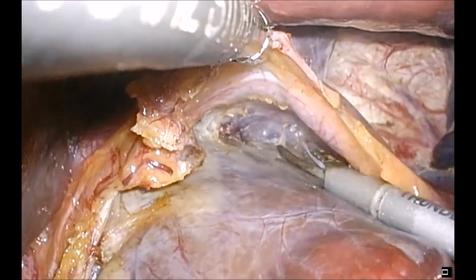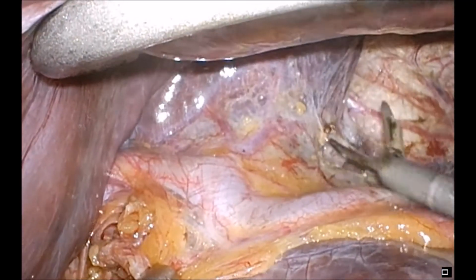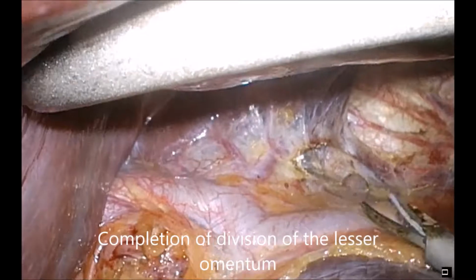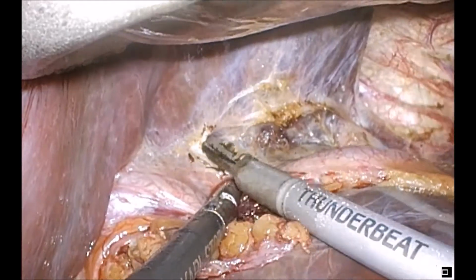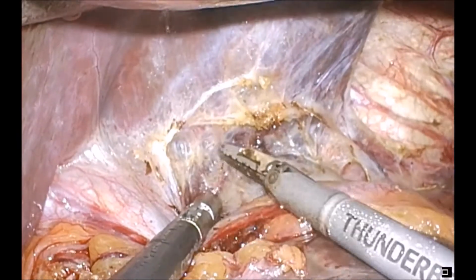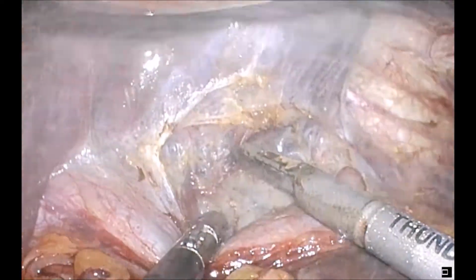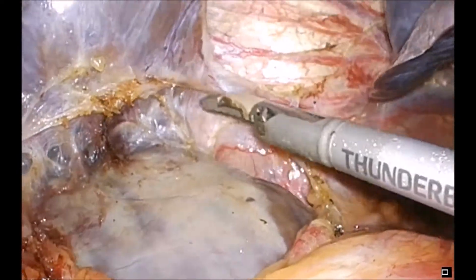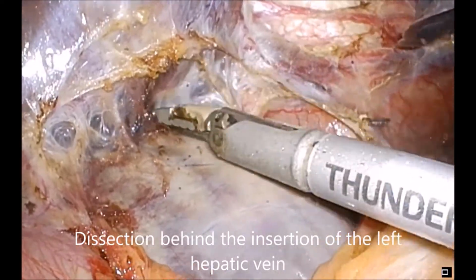You can see here dissection around the capsule of the liver and the caudate, dissecting up towards the base of the lesser omentum. Some large accessory vessels are prominent there. The Thunderbeat was very useful for this operation, as it has both a harmonic and a bipolar activity, allowing for blood sealing as well as reasonably rapid dissection. The video is running at twice normal speed here, and some editing has occurred to minimize the length of the video.